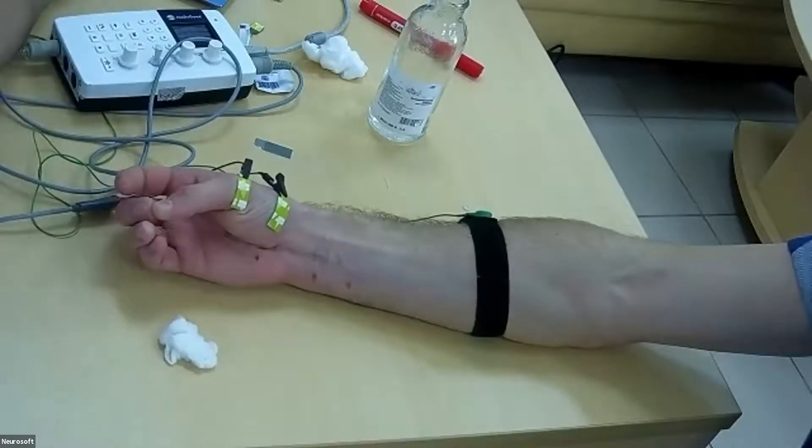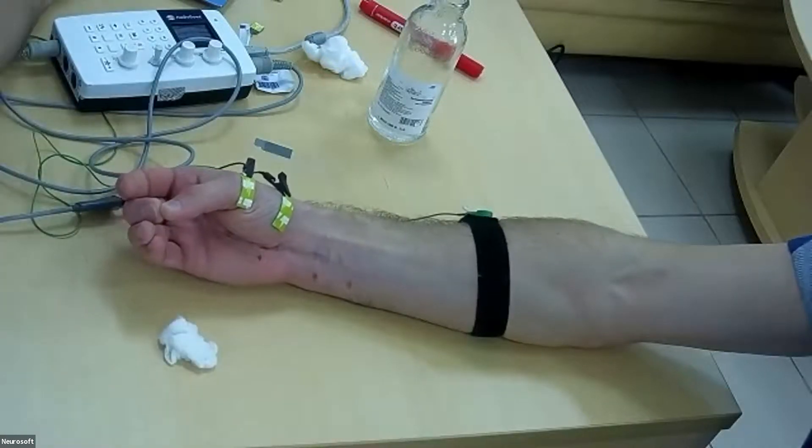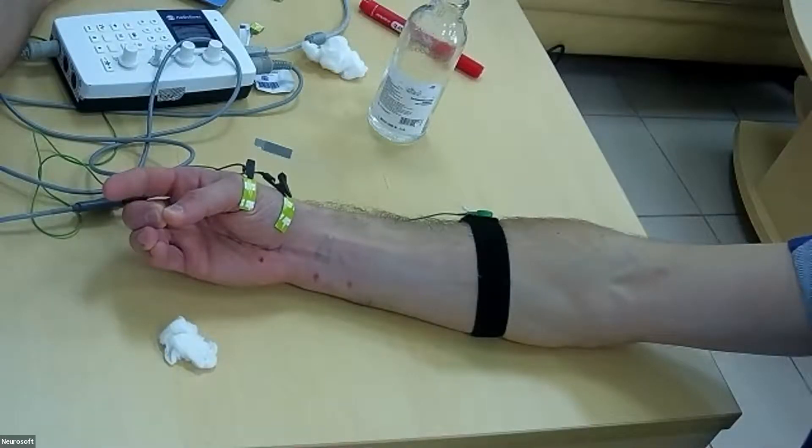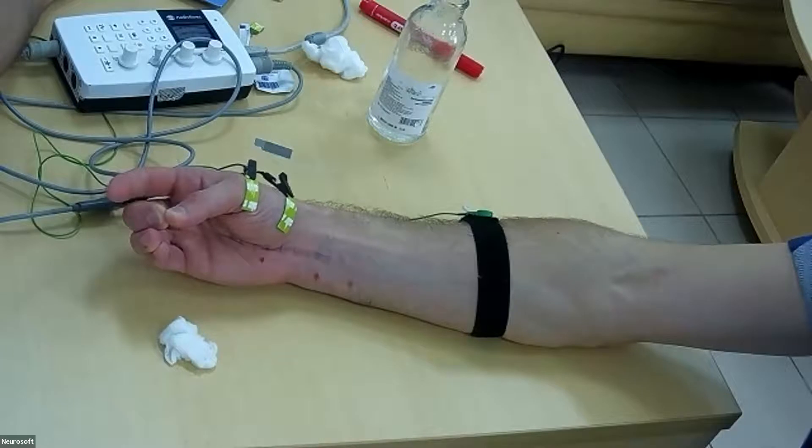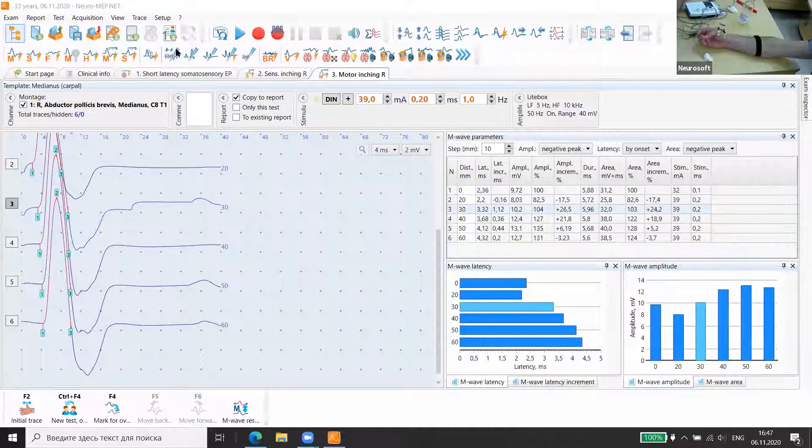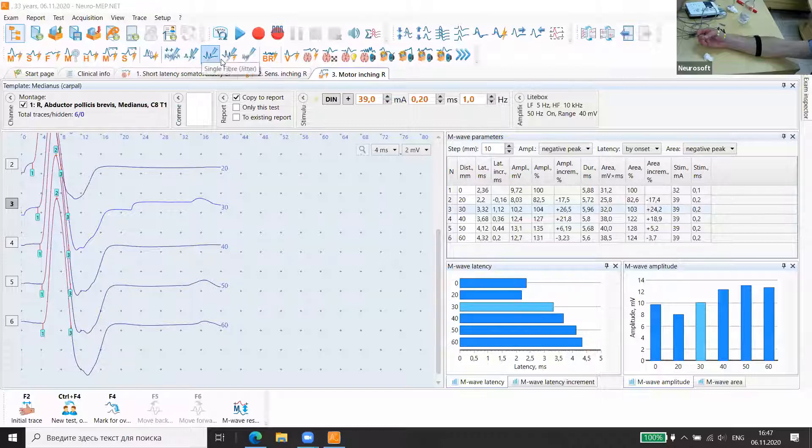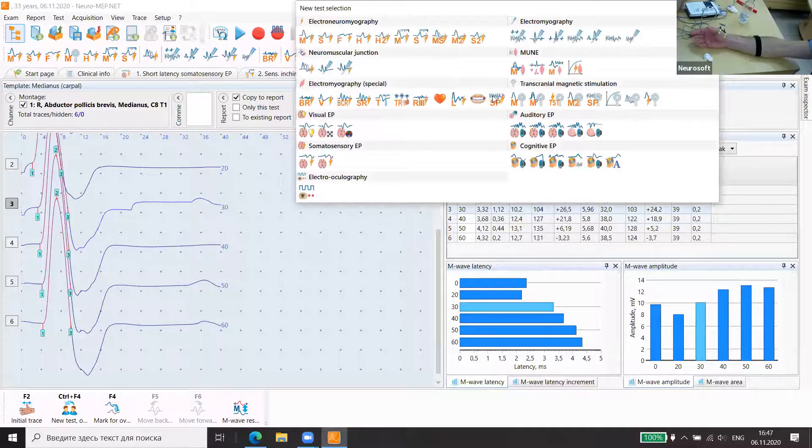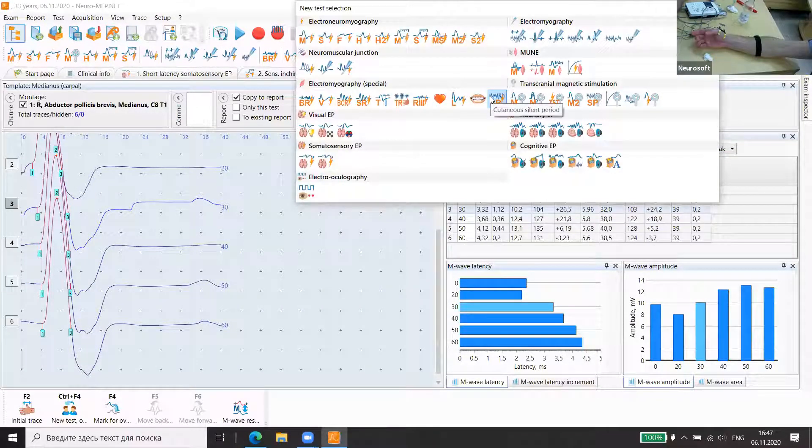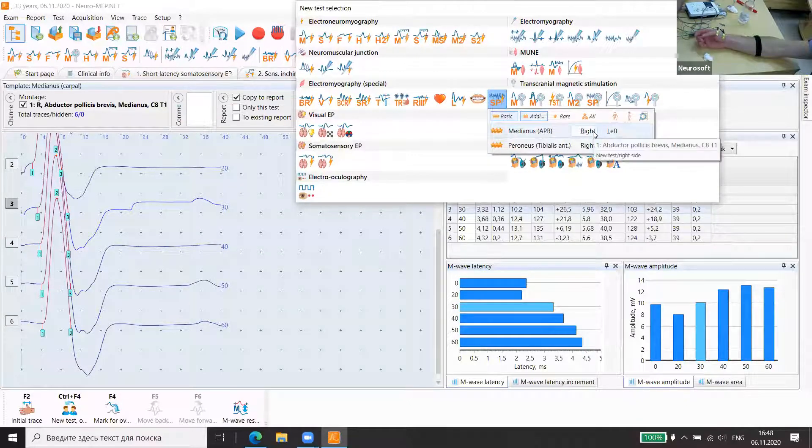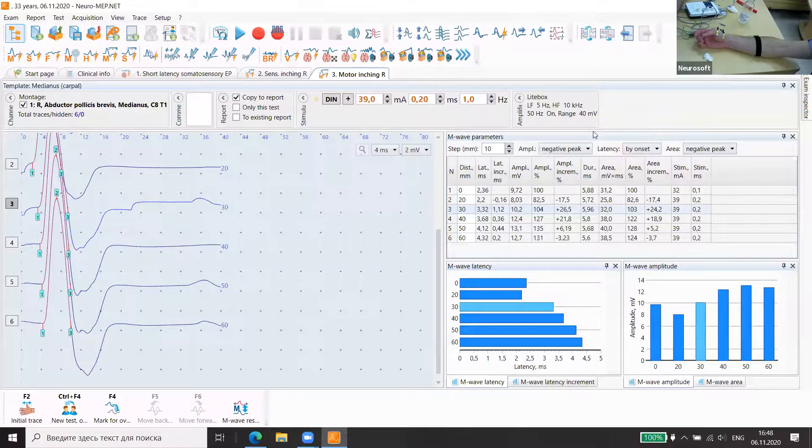Yes, so you can see here we choose demonstration. So we demonstrate. Now we choose cutaneous silent period from median, right?